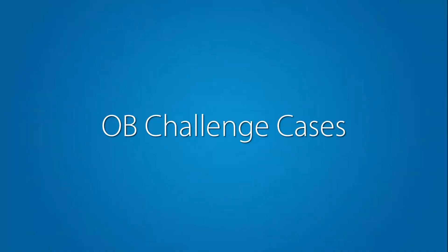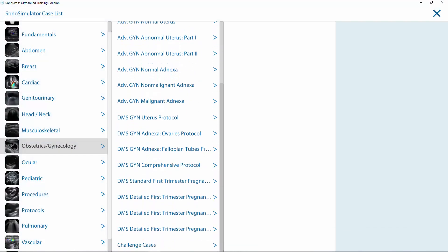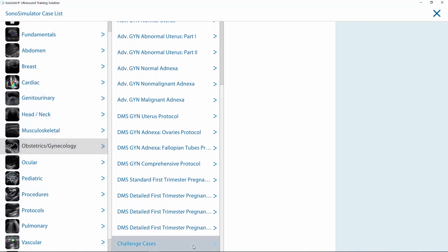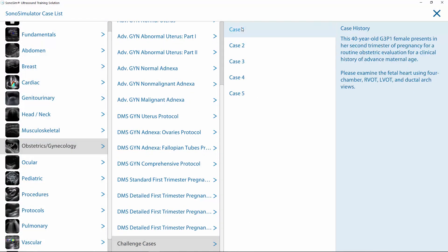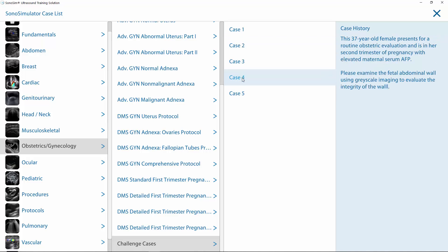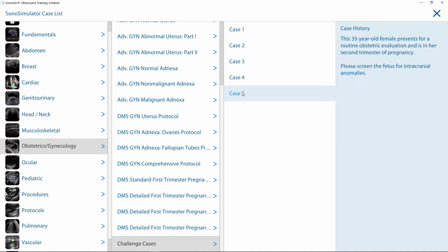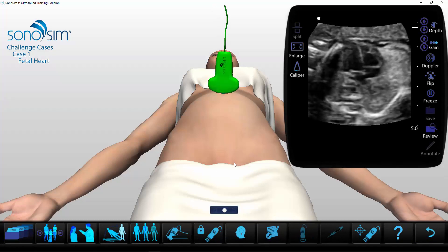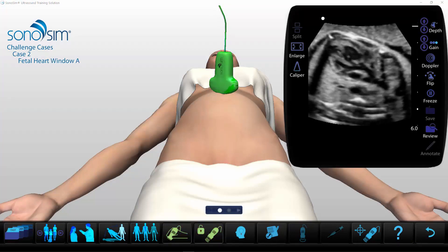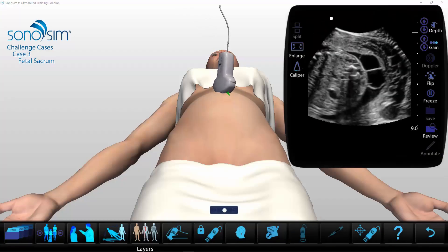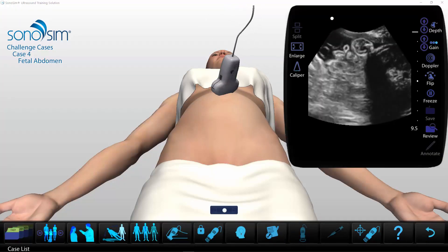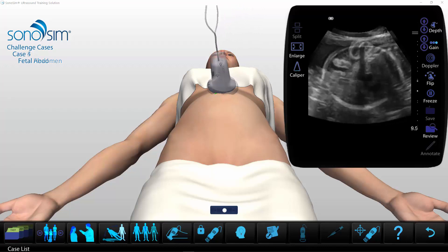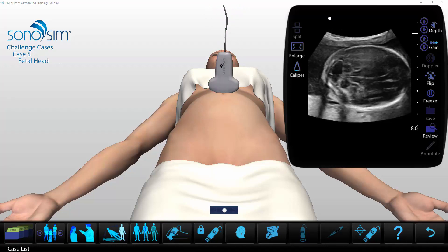In this Sonosimulator release, we are adding pathologic obstetric cases to the challenge case series. Sonosimulator scanning cases with unique pathologies appear as challenge cases within their respective categories. This latest release adds the following cases abnormal fetal cardiac scan: perimembranous ventricular septal defect, open spina bifida, gastroschisis, and posterior fossa fluid collection.